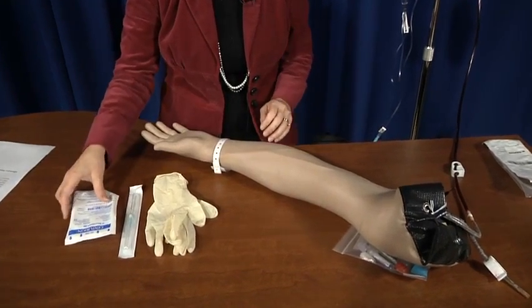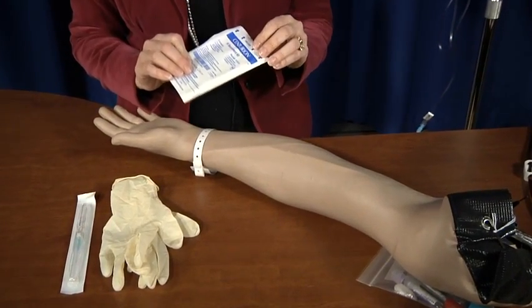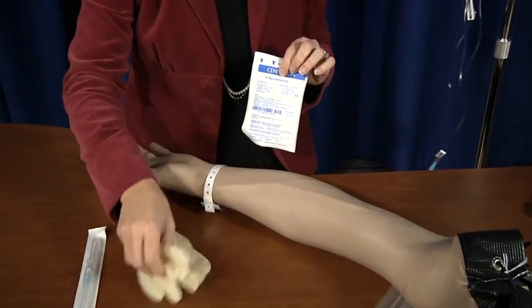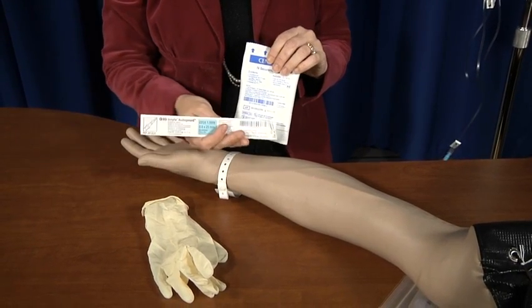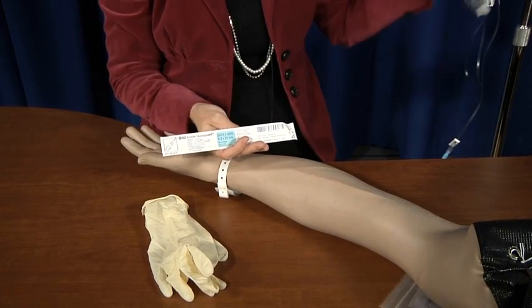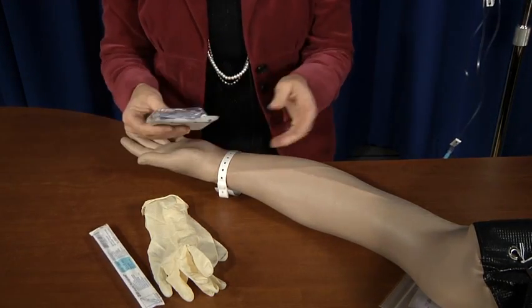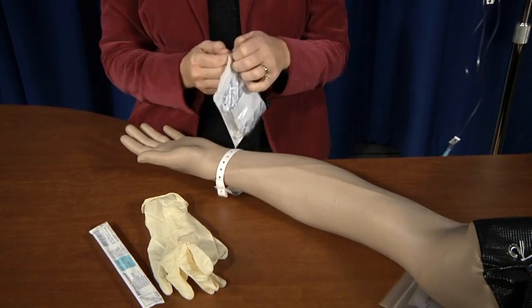And the way we do that is with some of the equipment that we brought along. This is an IV start pack or an IV start kit. We've got our gloves and we've got our catheter. This is a 22 gauge catheter. We're using that because we're only doing IV solution. So now that we have our equipment, let's take our tourniquet out and assess for a good vein.